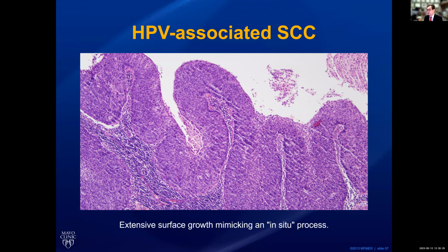This is very typical, and most of the time, the neck lymph node is cystic, and you do a biopsy, and the cytology can be tough, right? Because there is a lot of necrosis and some squamous atypia, it's hard to tell, but it's not a high-grade tumor, and that's where it makes it difficult. If it's a high-grade tumor, we are all very confident to call malignancy. And this looks like in situ even, right? But this so-called in situ pattern is not truly in situ because you see them in the lymph node already, and this can't be in situ anymore, right?